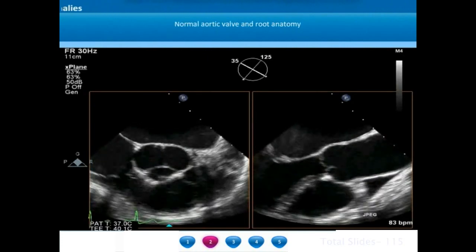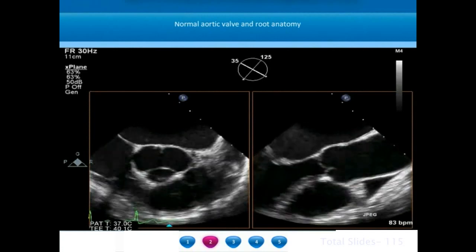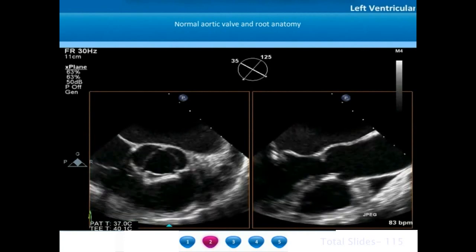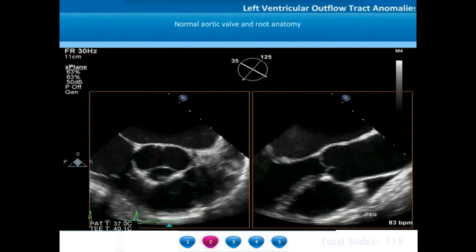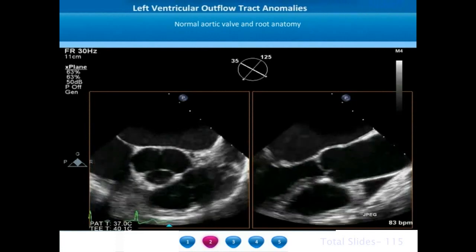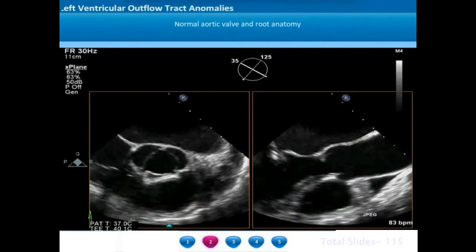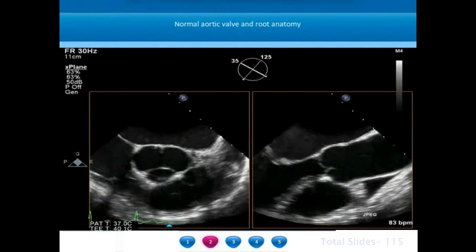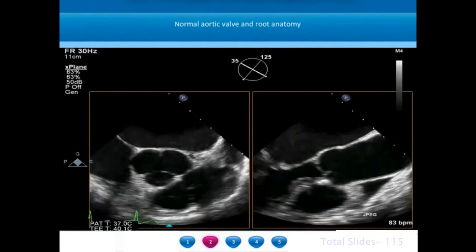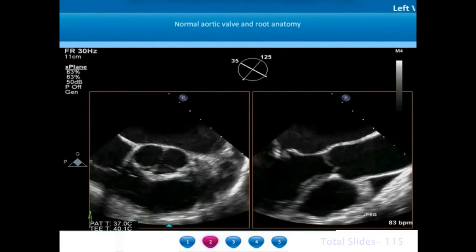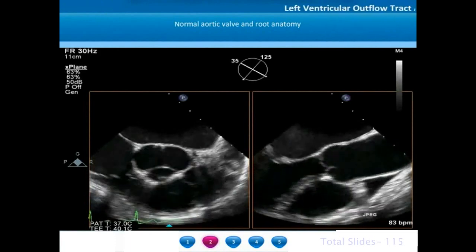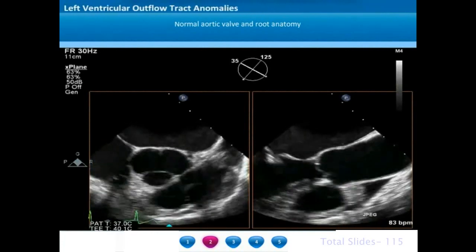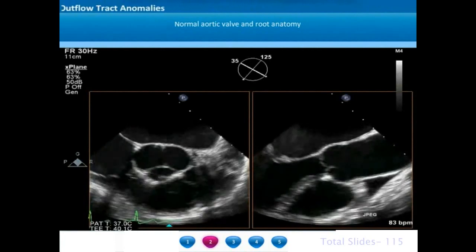The conventional way of echocardiographically analyzing the aortic valve and aortic root is by having a look at the short axis and long axis view. This is an x-plane imaging of transesophageal echo where we can get a simultaneous short axis and long axis view. In the short axis view we see the three leaflets namely the right, left and non-coronary leaflets, and in the long axis view we see the aortomitral curtain, the aortic annulus, the aortic root, sinotubular junction and ascending aorta.